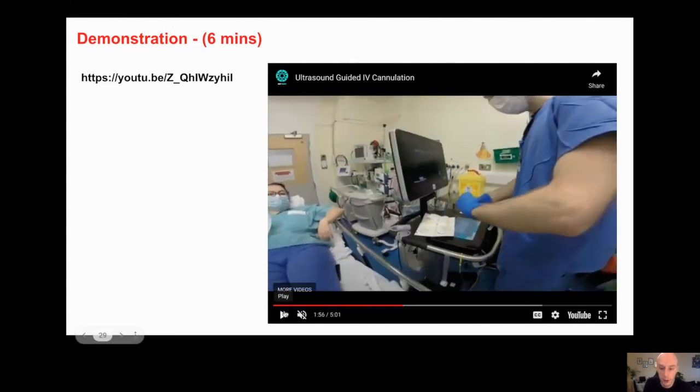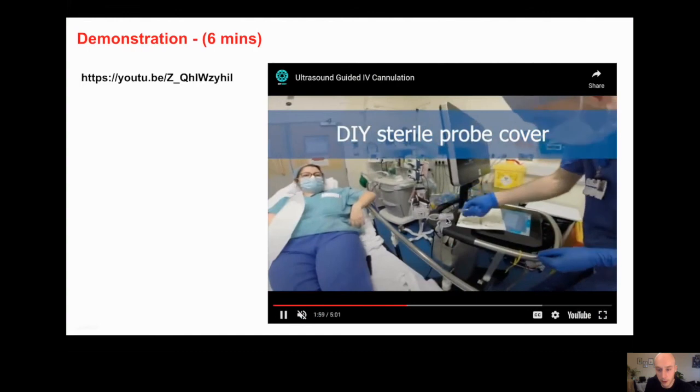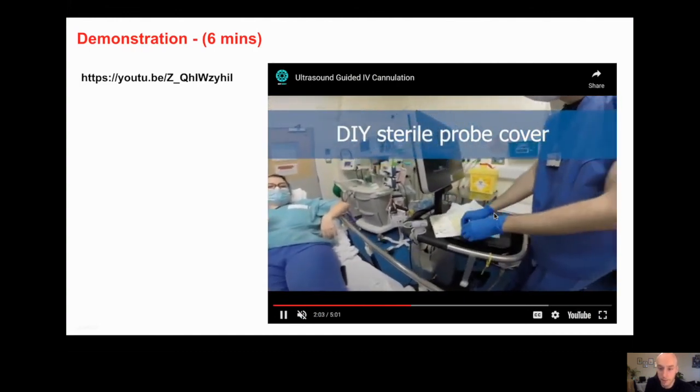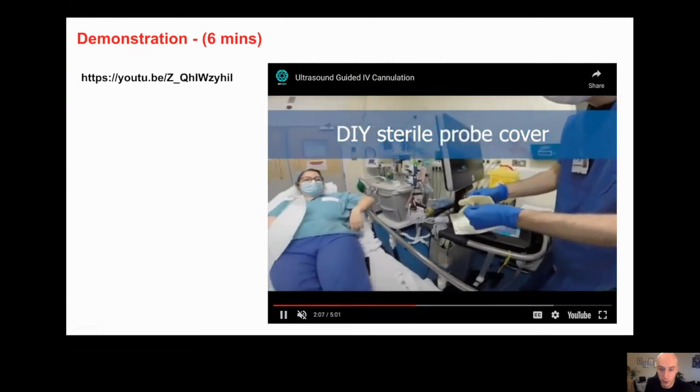So here is an example about how to make a sterile probe cover out of a sterile glove. I would recommend you just use the condom or the CVC probe cover now, but if you don't have any of those things, here's how you can make it. So you put your probe somewhere that's steady, so just put it in the machine, get your sterile gloves. Inside the glove is still sterile. You stretch it over your probe.